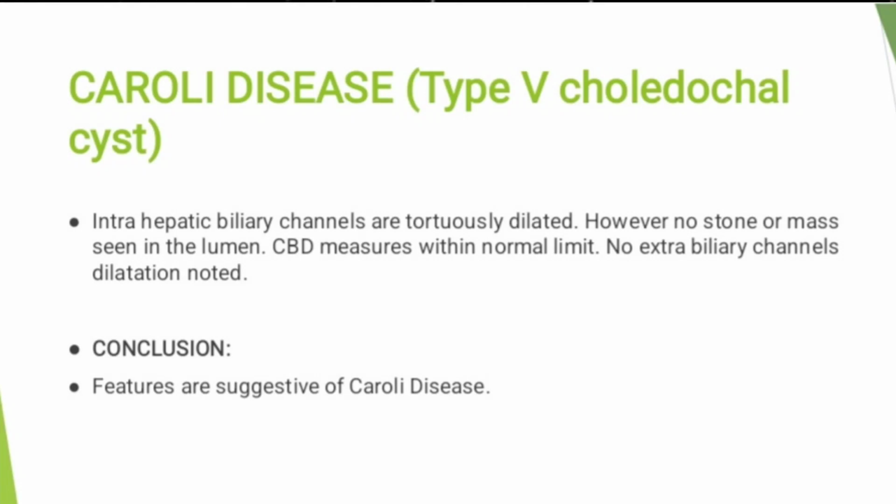As I mentioned, in Caroli disease there is particularly intrahepatic biliary channel dilatation. Extrahepatic channels will be alright. There will be no CBD dilatation and no other extra-CBD problems. So this is the typical feature of Caroli disease, and you have to write it this way.